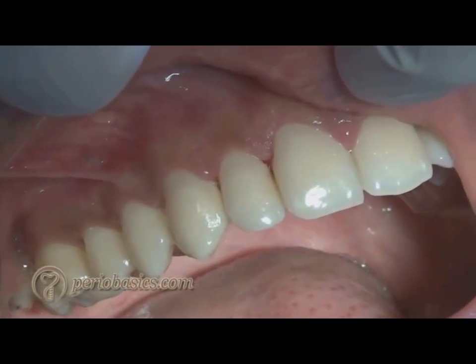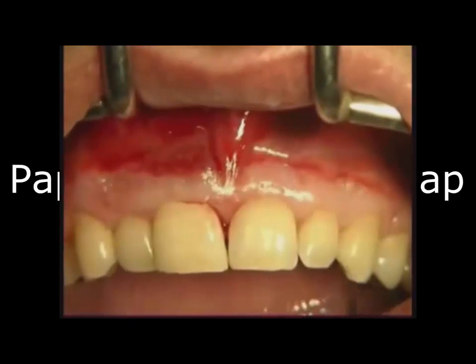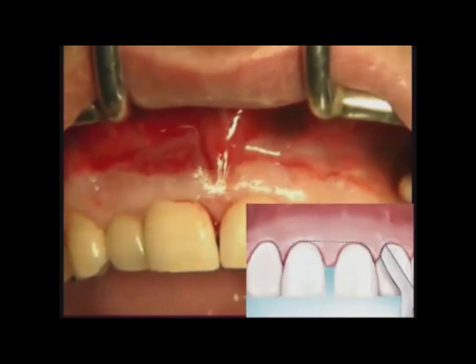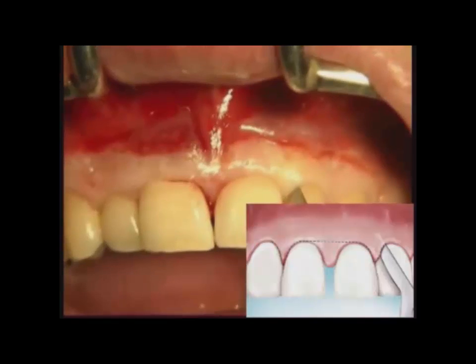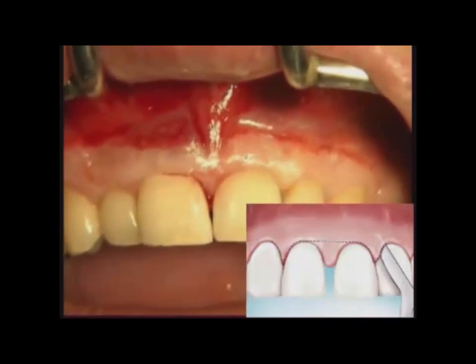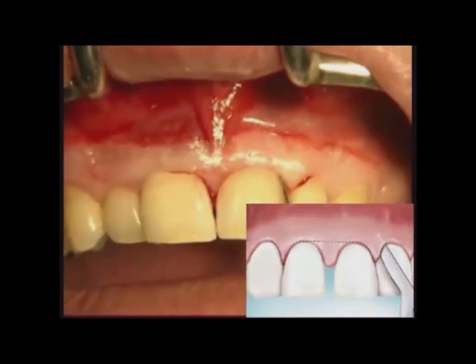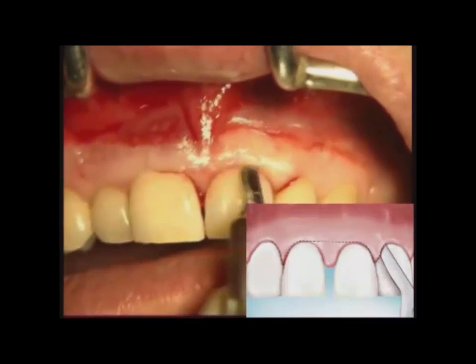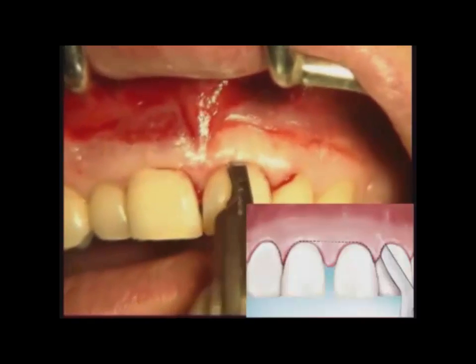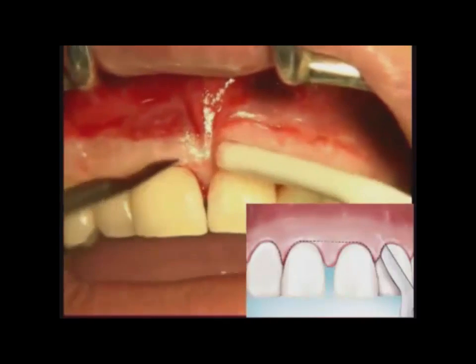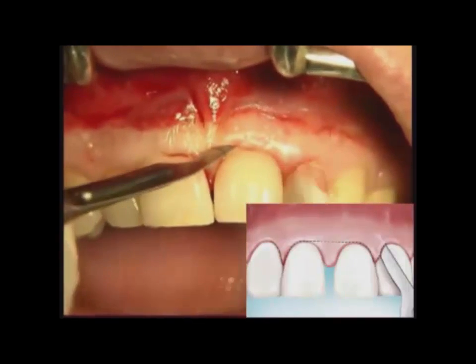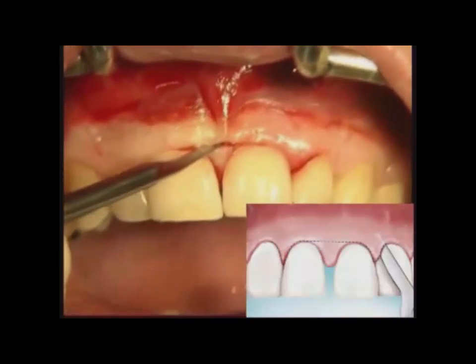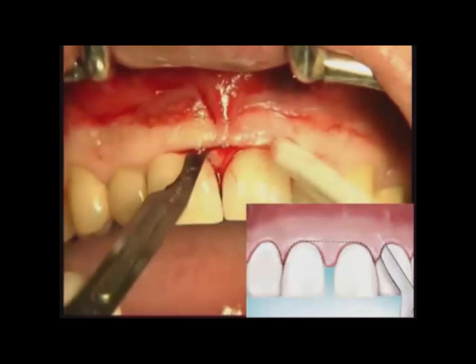Moving to the last technique, which is the Papilla Preservation Flap. An intracrevicular incision is done first. Notice that she is going to go horizontally through the papilla and will not do the intracrevicular incision in the region between the incisors. You will understand later why this technique is done.